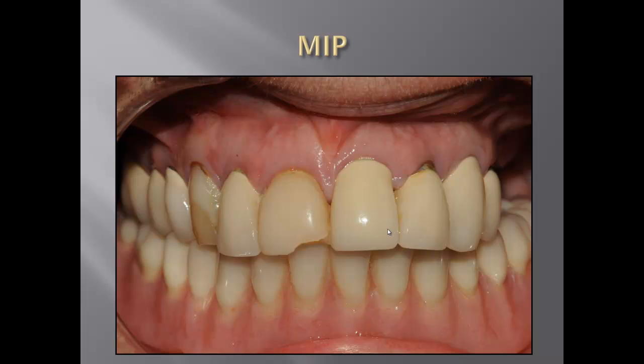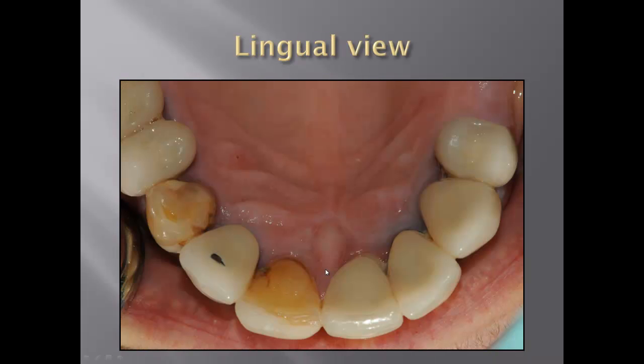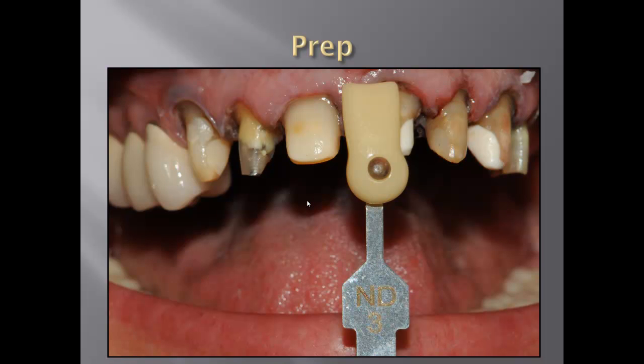So what I've been doing in this case is we took some pictures and x-rays, collected data, and we saw some secondary cavities all around the crowns and some virgin teeth which had never been restored. We removed the crowns, we removed the secondary decay, and also for my technician, I took a stump shade of the patient's preparation, so my technician knows how to cover those restorations and establish a nice aesthetic result.